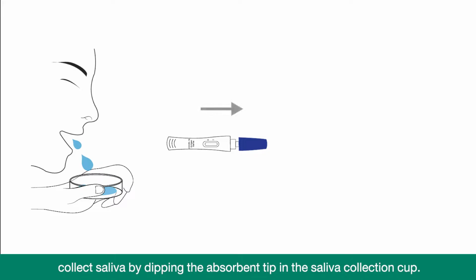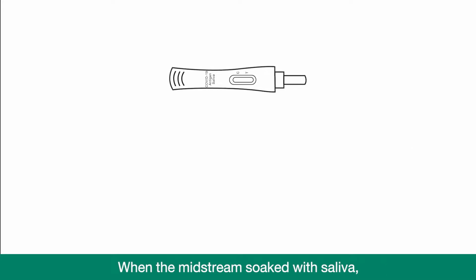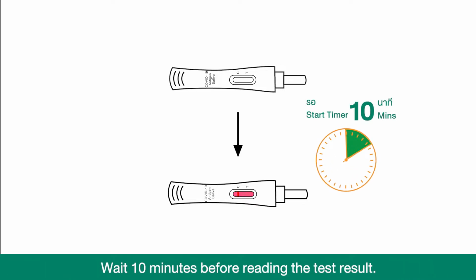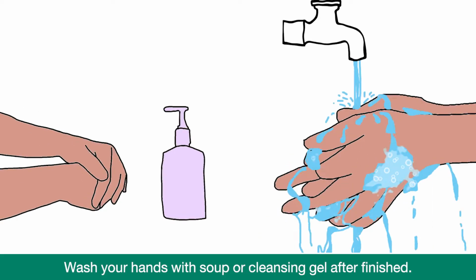Collect saliva by dipping the absorbent tip in the saliva collection cup. When sampling, let saliva naturally absorb on the absorbent tip. When the midstream is soaked with saliva, you will see the purple color move across the window in the center part of the midstream. Wait 10 minutes before reading the test result. Wash your hands with soap or cleansing gel after finishing.